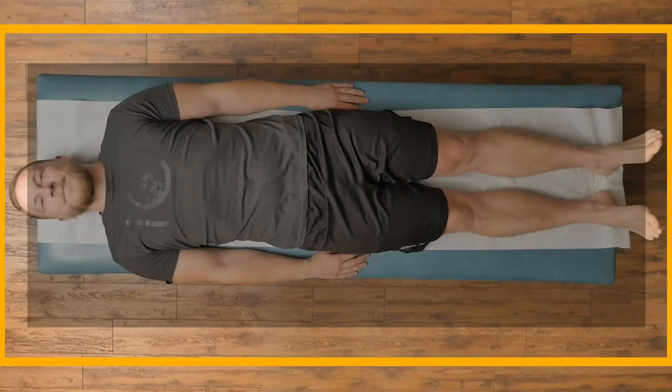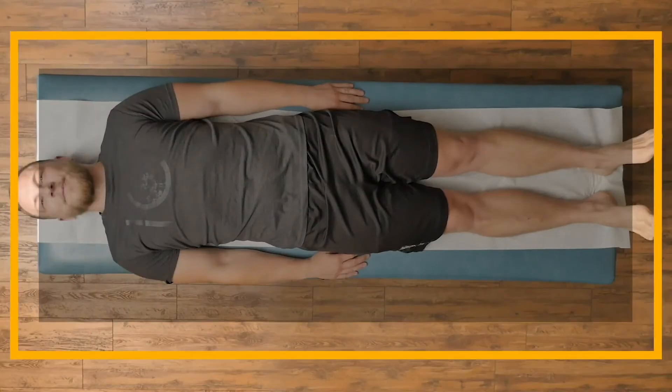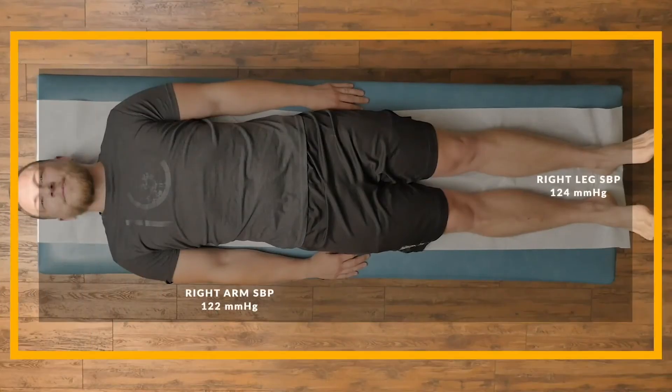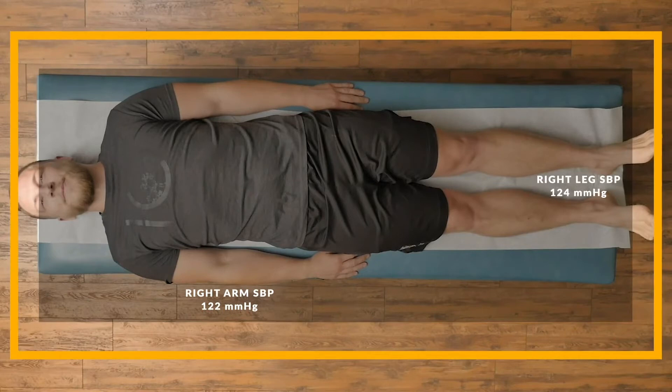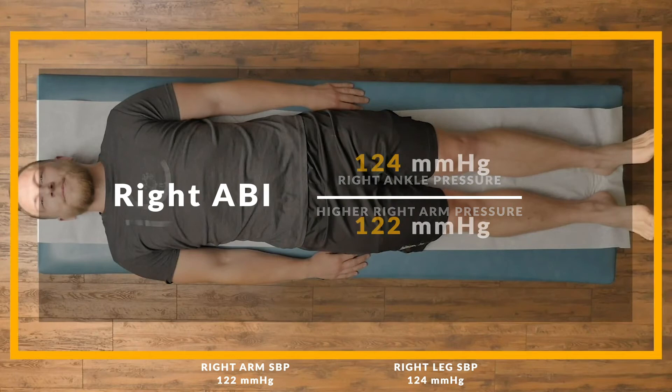To calculate the ABI, use the highest of the two brachial artery pressures, then divide each respective leg pressure by that highest brachial pressure. For example, our patient had a higher right arm pressure, and as such his calculation would be as follows.